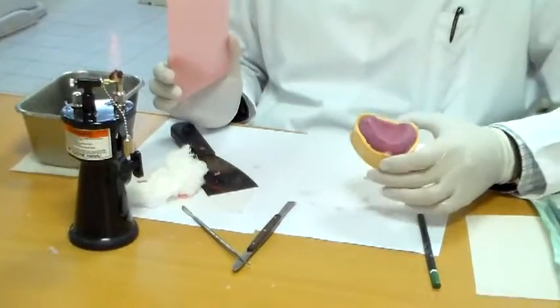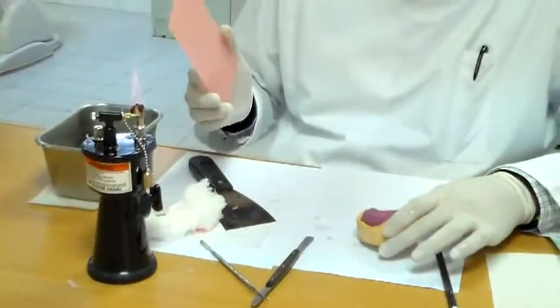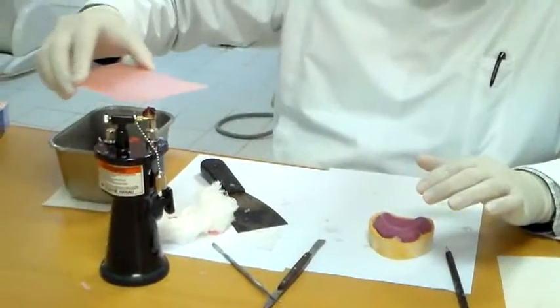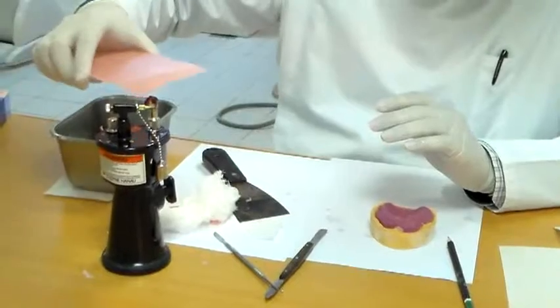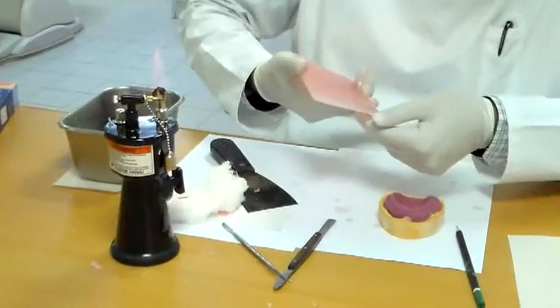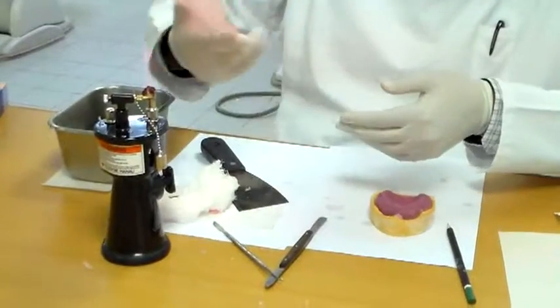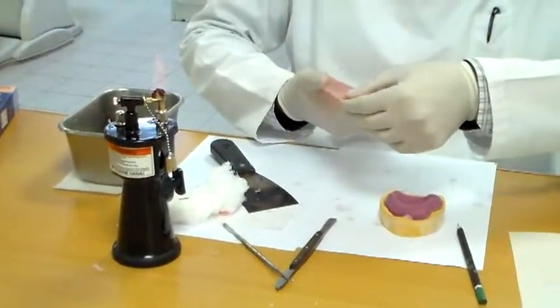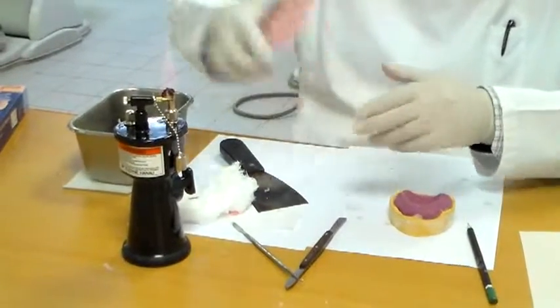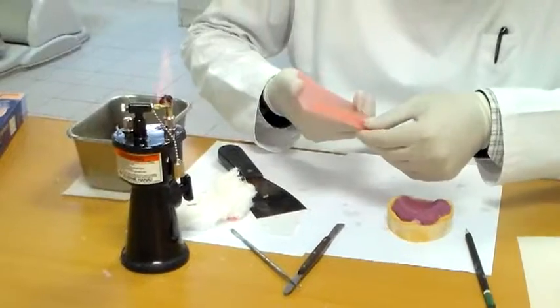We're going to make the occlusal rim for the upper, and the record base is ready. I'm just going to add on the wax. I'm going to soften it up on a dry flame. So you take a small part first, make sure you remove all the air bubbles, compress it well.